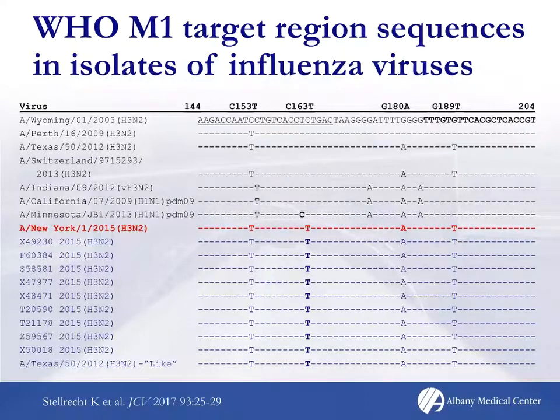The New York State Health Department is physically across the street from us, so it wouldn't be surprising that the samples they got from our region would be somewhat similar to the rest of our viruses. They probably identified it as Texas-like from the HA gene, but it must be a chimera with a different matrix gene.